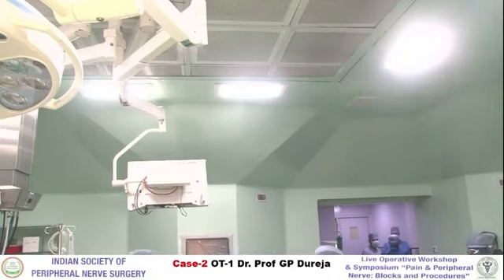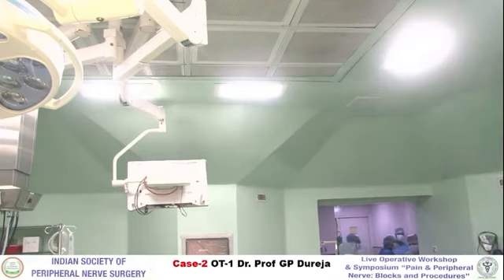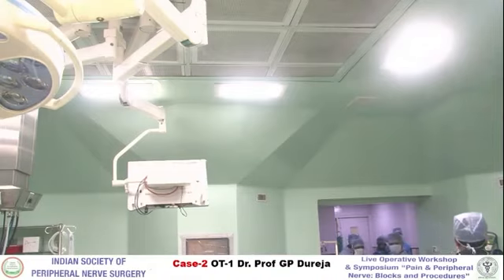Okay. Take one X-ray shot, please. Okay, now slowly pull back about half a centimeter, and then we'll show them. Shoot. Okay, so this is where the foramen ovale is typically. This is where the needle tip is. Right. Now we are pulling it further.